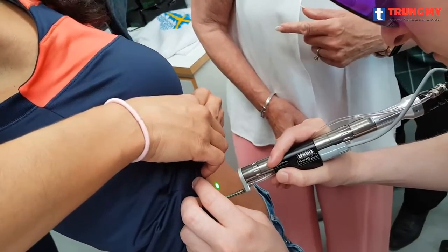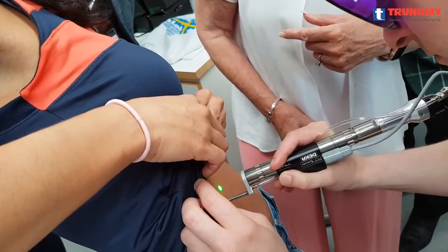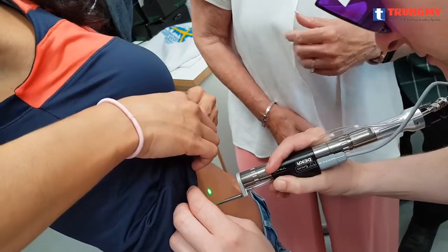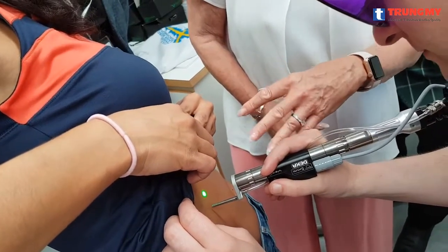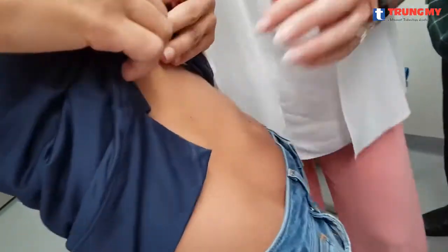Focus in the middle. Don't press. Should I press now? No — yeah. Should I press? Yes. Good. One is up. No, no — one is up. It's okay. Stop. Just one. Can you take off your left? Yes. Just one — one is enough. One treatment.